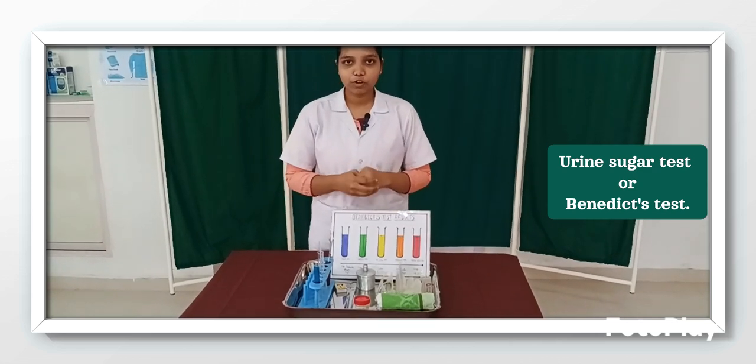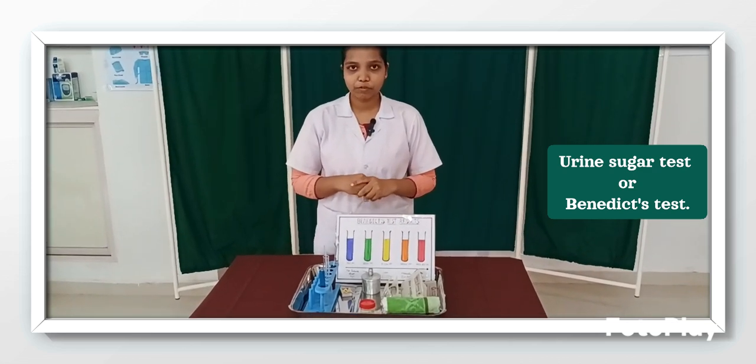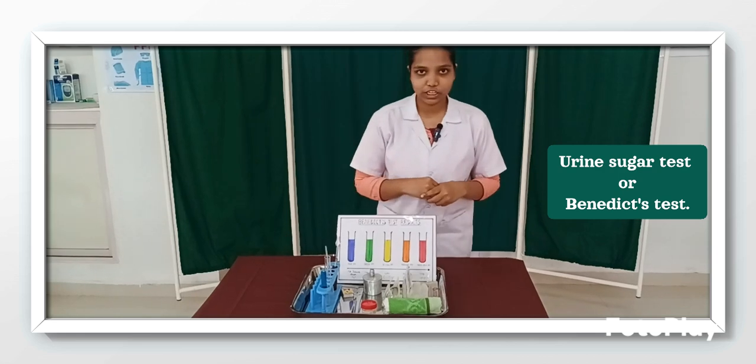Before the procedure we have to wash our hands. Here I already performed the hand hygiene. I am going to wear the gloves.